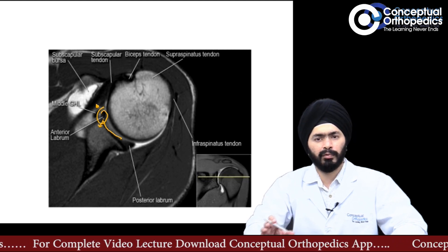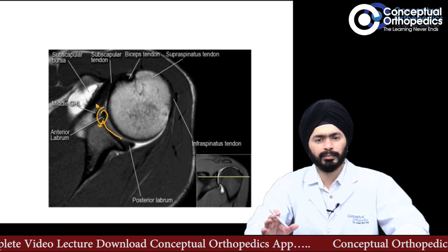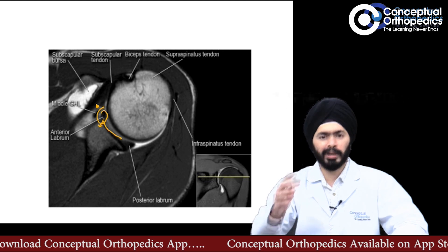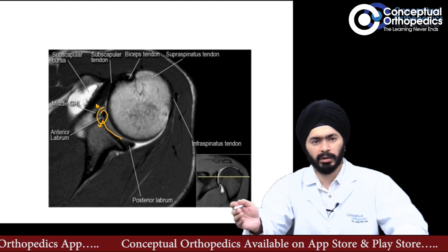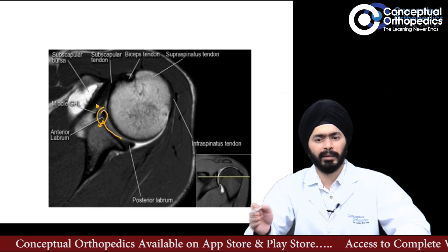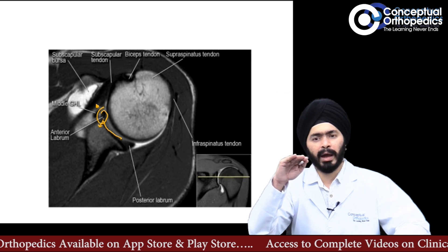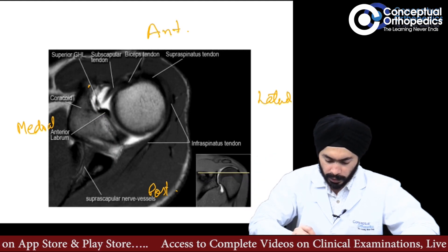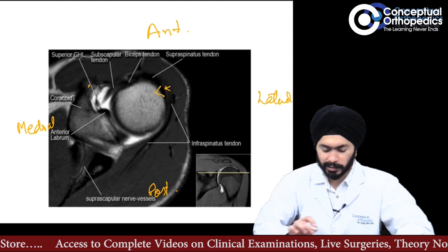Another important thing to look for in axial sections is the Hill-Sachs lesion. The Hill-Sachs lesion is always found superiorly — you have to look at the posterolateral aspect of the humeral head in the superior sections. At or above the level of the coracoid, if you see a dip in the posterolateral humeral head, that is your Hill-Sachs lesion.